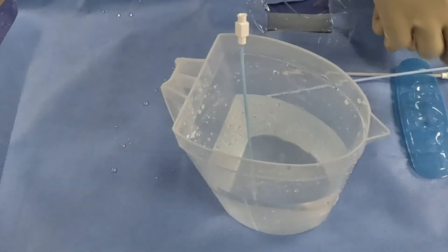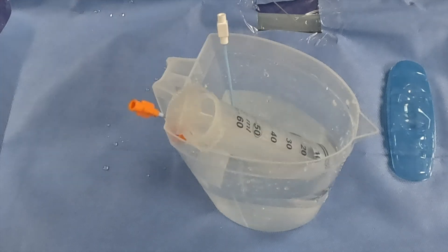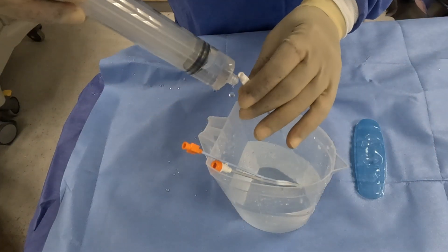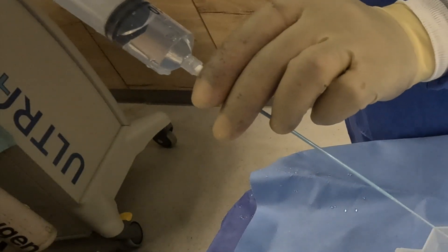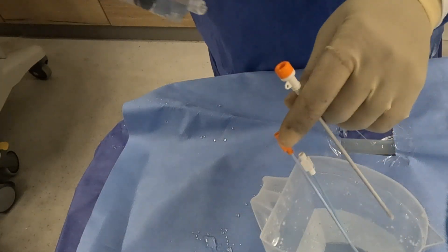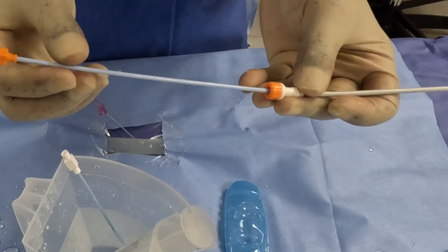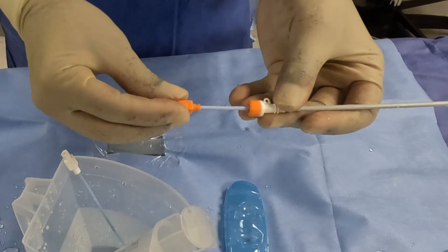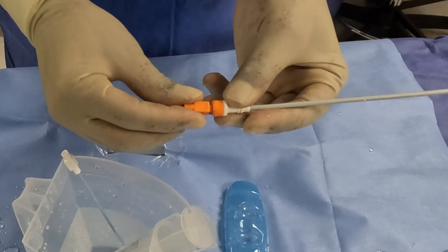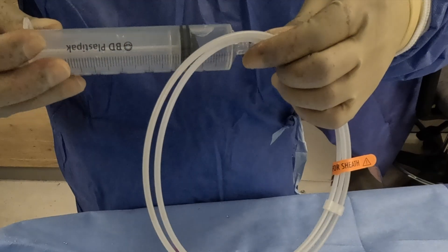Before the procedure, place the dilator, sheath, and sheath dilator in a jug with some saline. Then flush the dilator, sheath, and sheath dilator to make sure they are not blocked. Insert the dilator into the sheath hub and twist-lock in place to secure. Flush the guide wire as well.